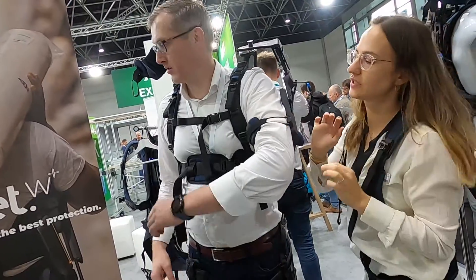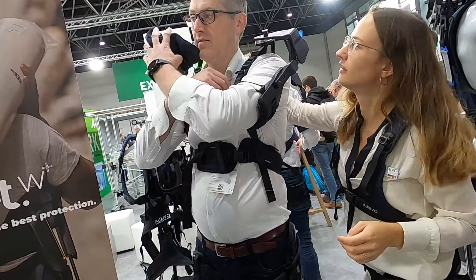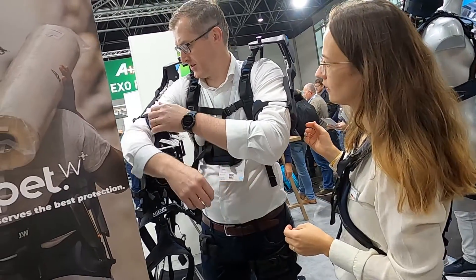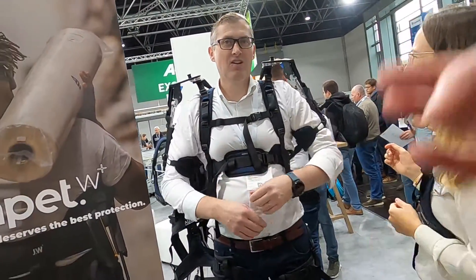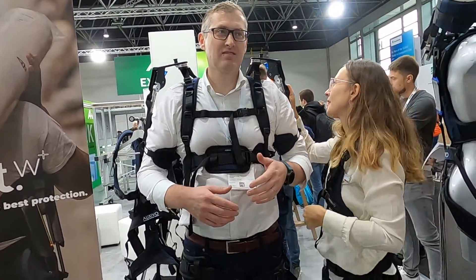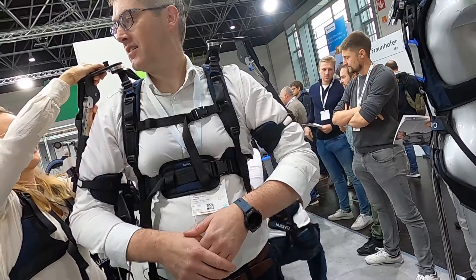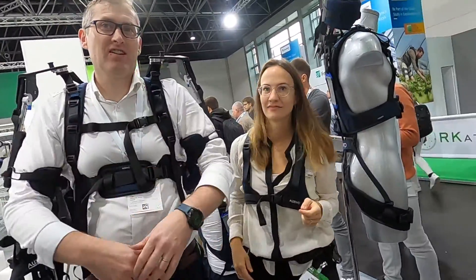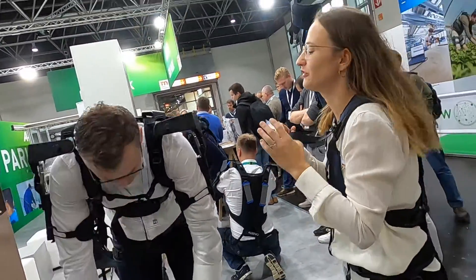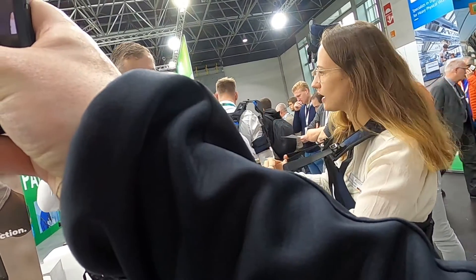Then close this one — there's a lock first. We have two support levels; this is the first one, and then I can also change it to the second one. You can really feel that — your arms are flying. You have to first activate it with these two, and then just hold.